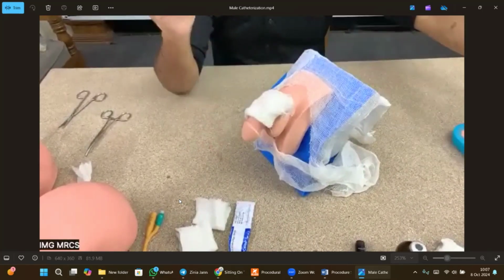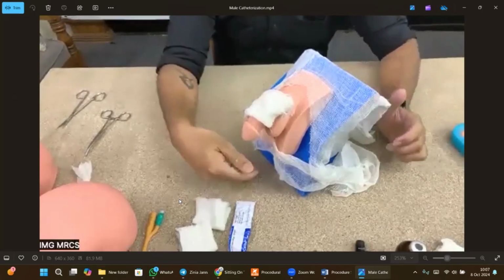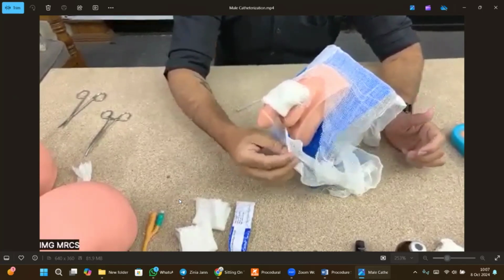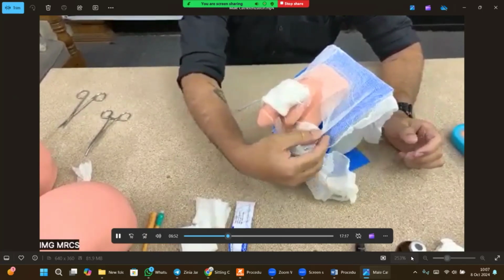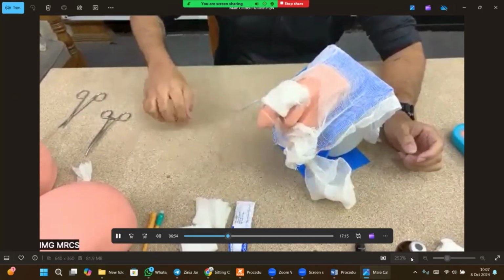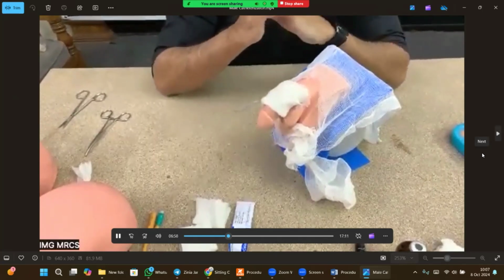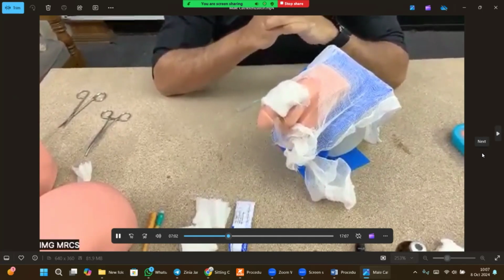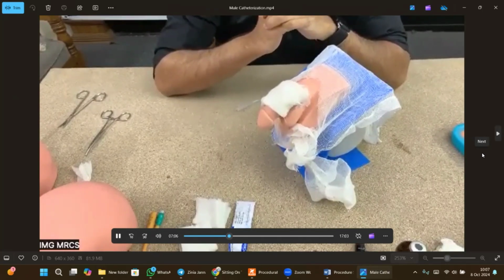Okay. So suppose the 3 minutes is over. At this point, we have put both gloves at the beginning, and just remove the... No. Don't show them tricks like this, okay? So you have to put them separately. Yes, sir. You remove one glove and then you put on the other one.